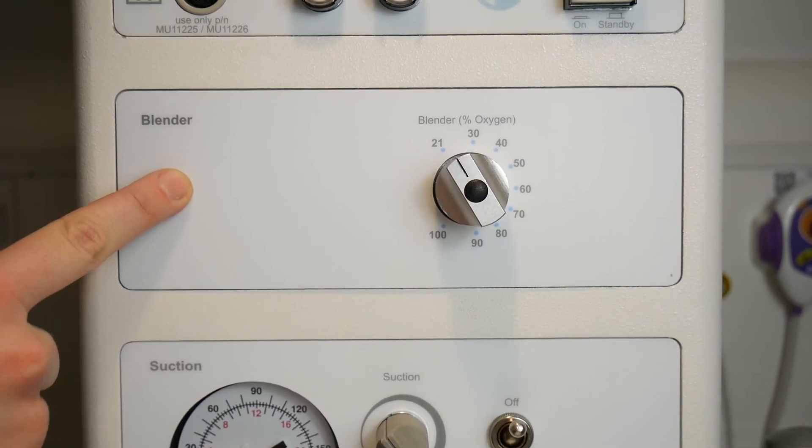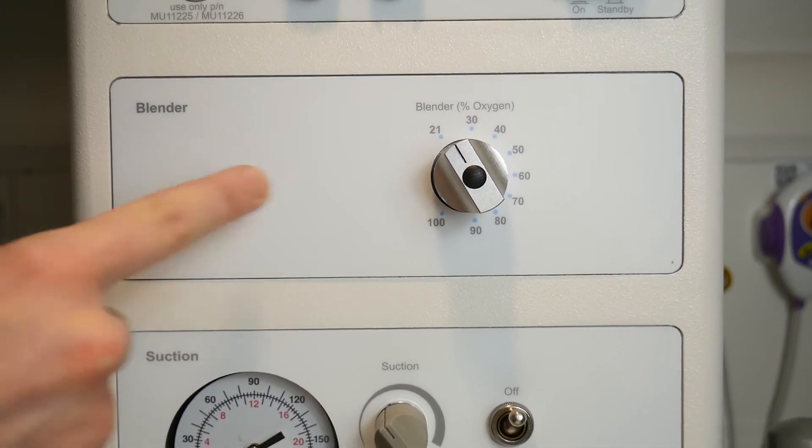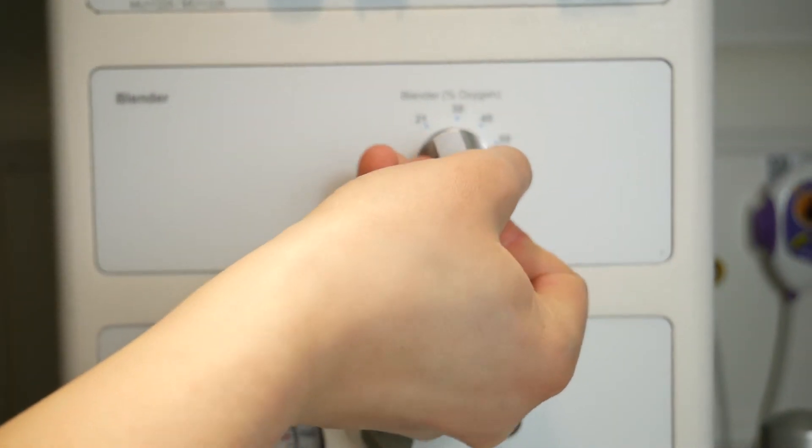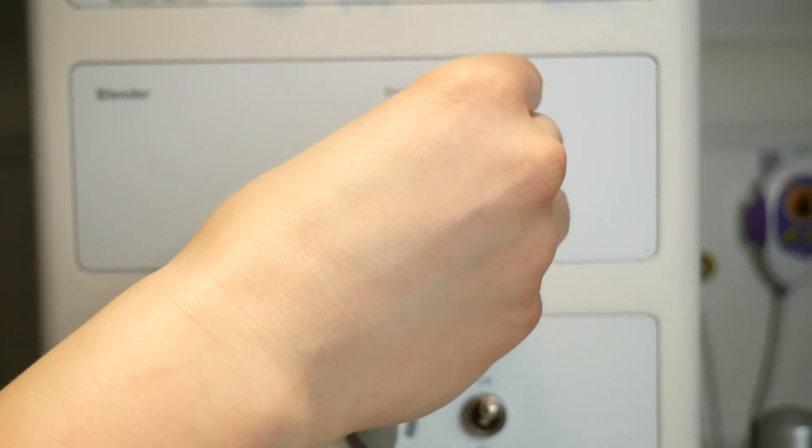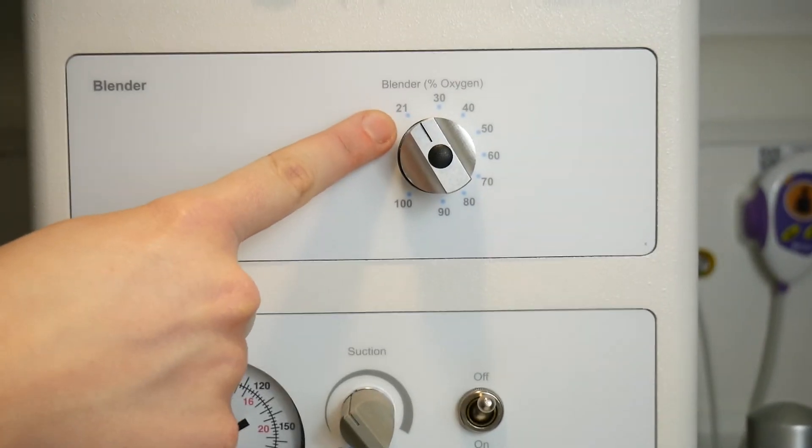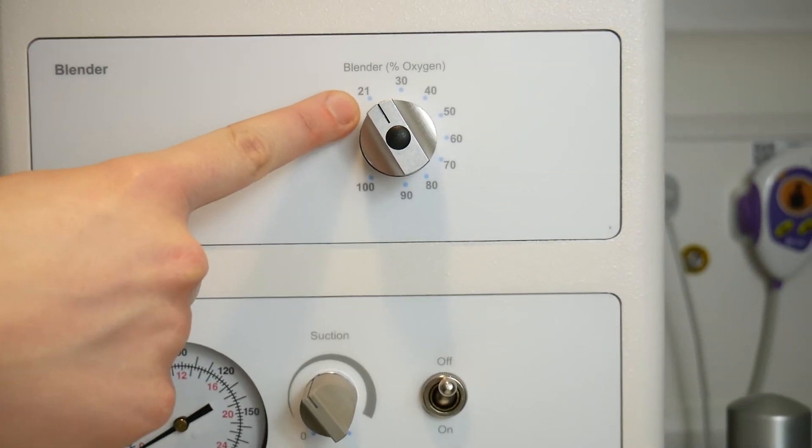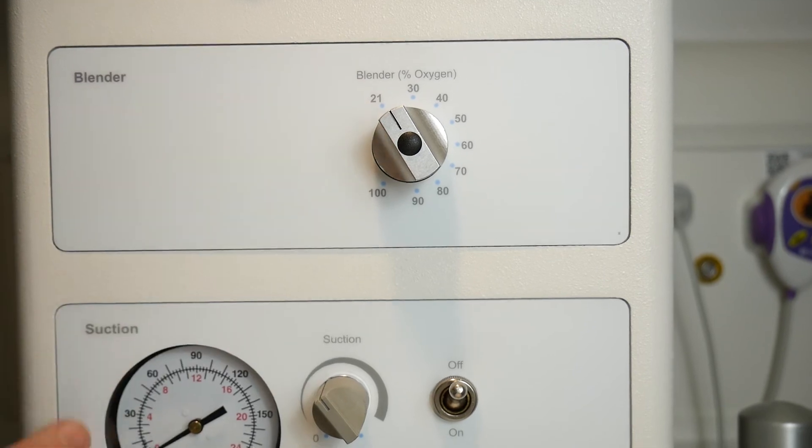This blender corresponds to the FiO2 of the gas coming out of the auxiliary gas port that you'll see in a moment. You can dial it up or down. Most people set the initial FiO2 as 21% so that you're resuscitating on air.